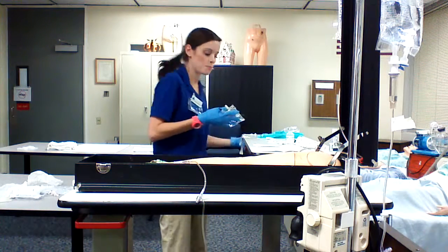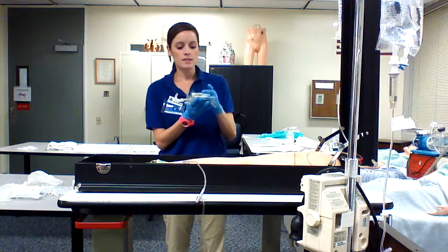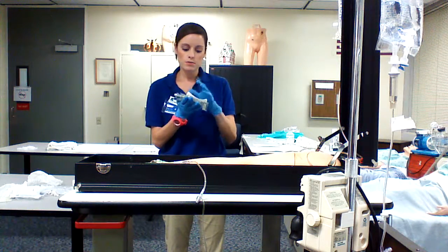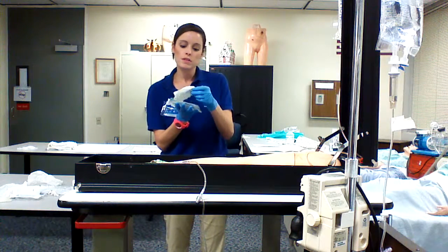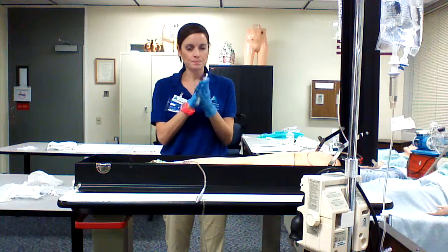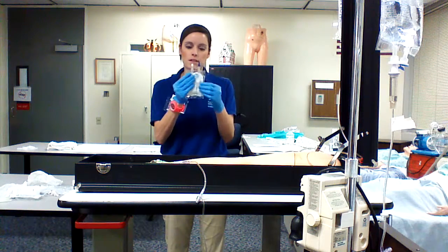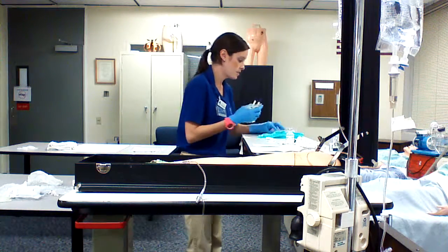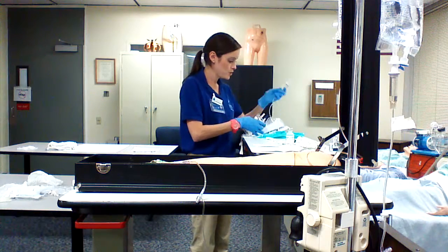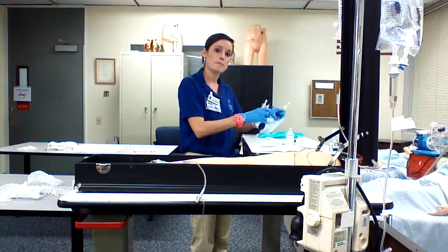Okay, so I have a label prepared, and it has the patient's name, the drug, the dose, which is 2 milliliters per time, and my initials. And I'm going to attach that to my mini bag. And now I'm going to attach my needleless device from my tubing to my mini bag.